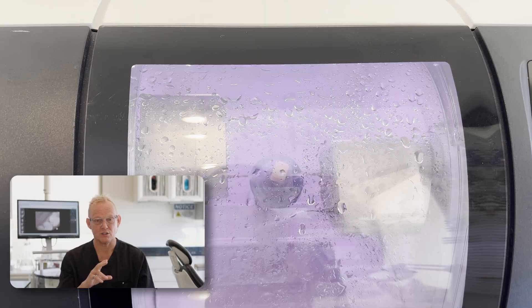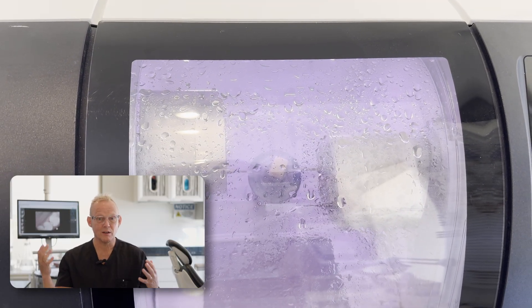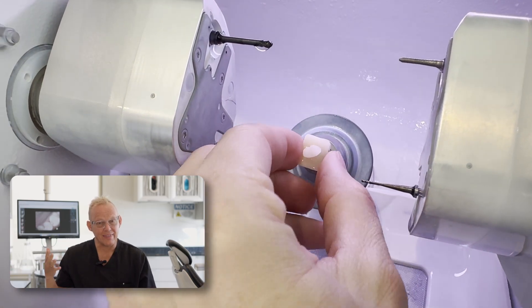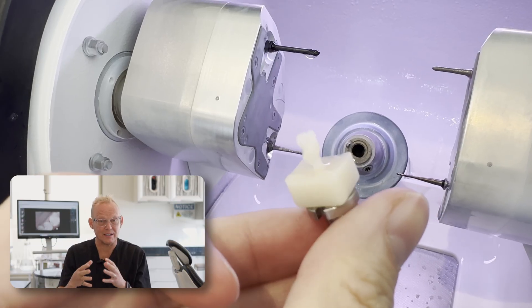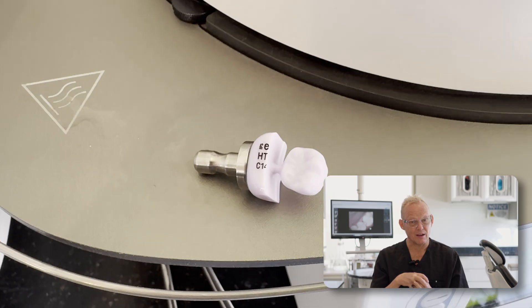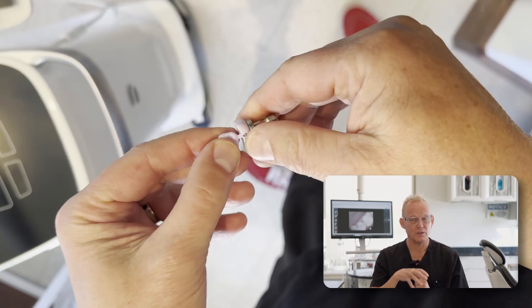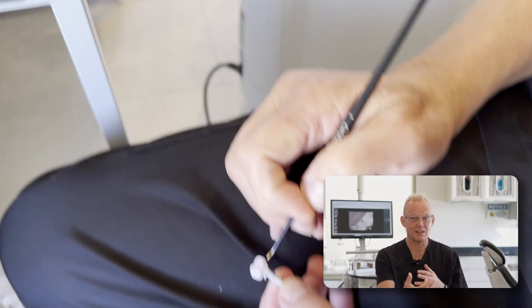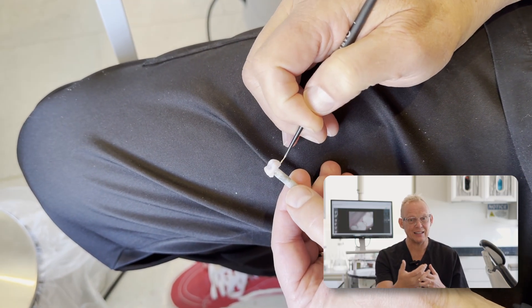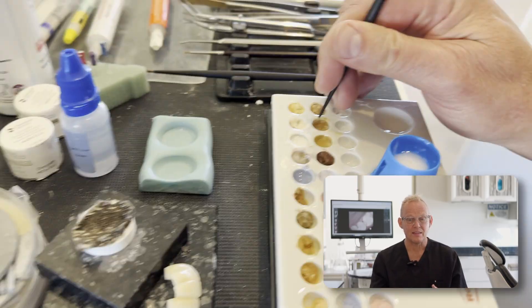The crown is cut out of a solid block of porcelain of my choice that matches the tooth structure exactly. The partial crowns on top were polished and naturally blend in with the surrounding tooth structure — you can't even see where they are. For the complete crown on the bottom, which covers the whole top of the tooth, I used a special material and then did a custom stain and glaze to match exactly the teeth in the quadrant.